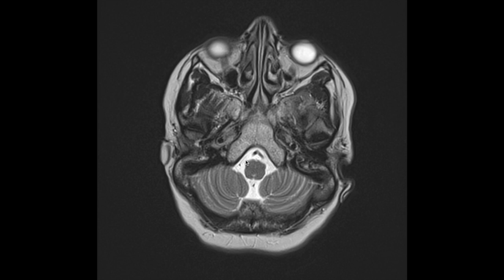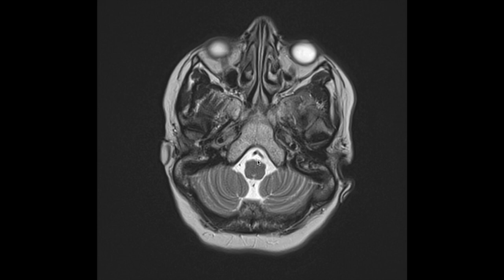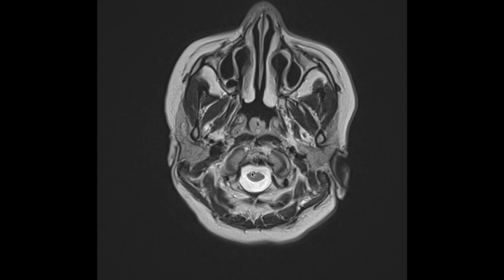Coming down further still, we have the medulla oblongata, which is continuous with the spinal cord. We've briefly touched upon the venous sinus anatomy.